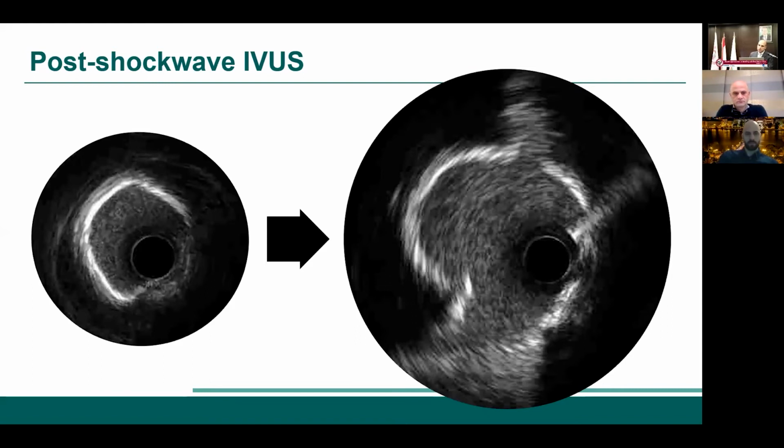And again, we thought we'd be fine. We cracked the calcium, meaning that we will be able to expand. Technically, think about it, and I'm sure Dr. Edis will talk more about his algorithm. But clearly, we got rid of that rock pile there. That's 270 degrees of calcium. However, what we did not expect is, believe it or not, with the guideliner in place, we could not deliver our stent. We cracked the calcium, we were able to deliver our IVUS catheter, but the stent would not go.